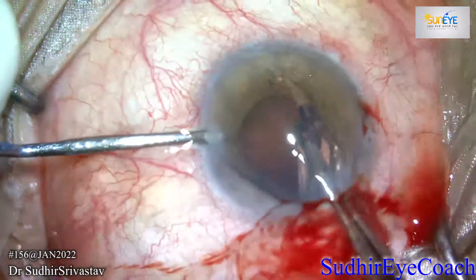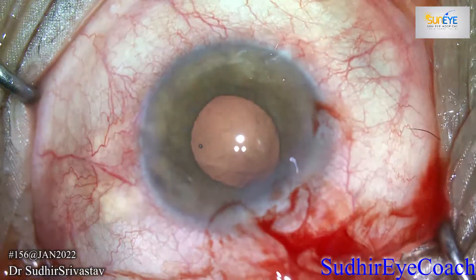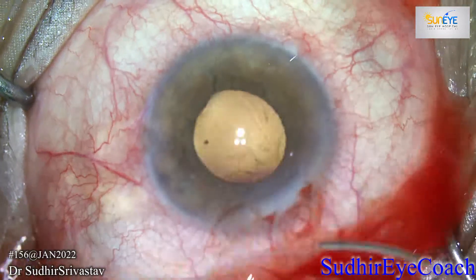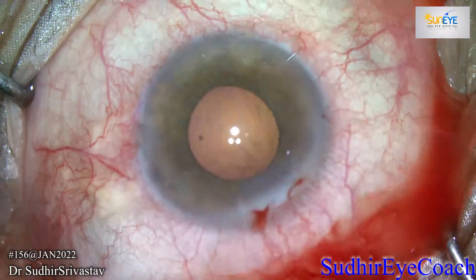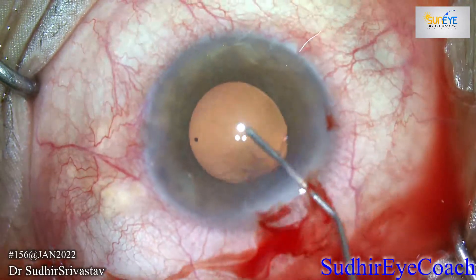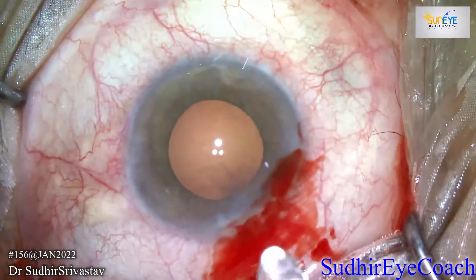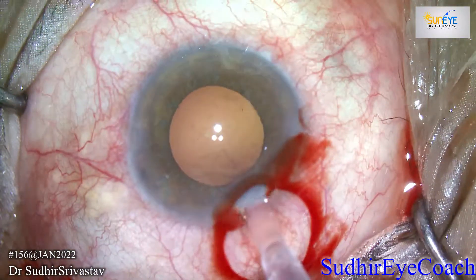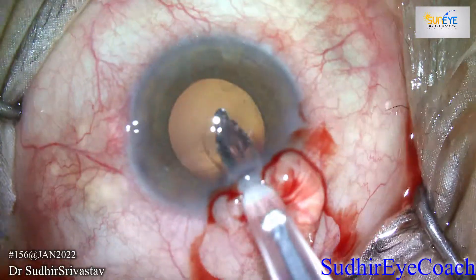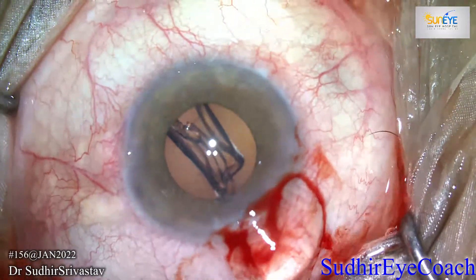Successfully, we can fold the intraocular lens. A folded IOL can be easily explanted through the 3.2 millimeter clear corneal incision. Selection of viscoelastic is very important — always try to use a combination of dispersive and cohesive viscoelastic for safe and better results. Always select a firm and hard iris repositor. After successful explantation, I filled the chamber with viscoelastic and implanted a fresh hydrophobic implant inside the bag.